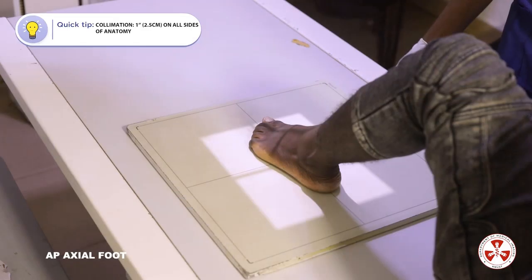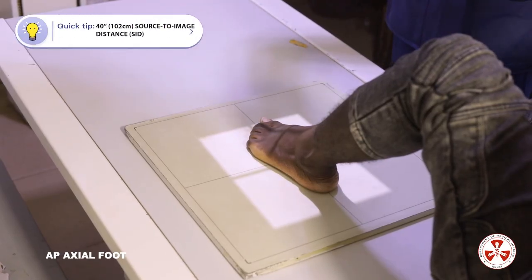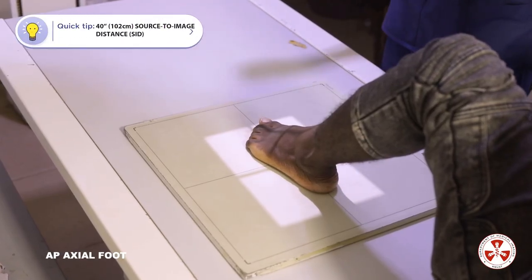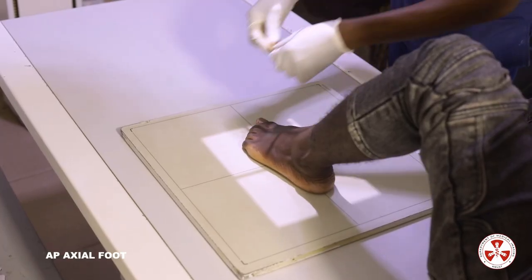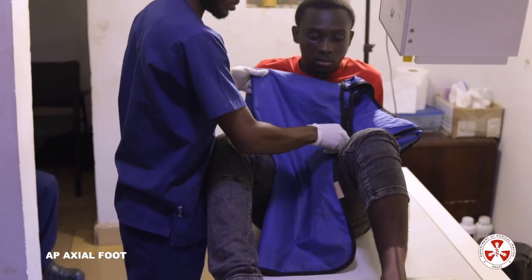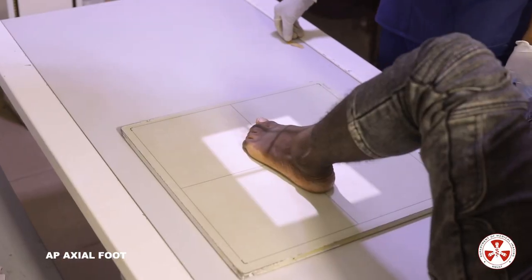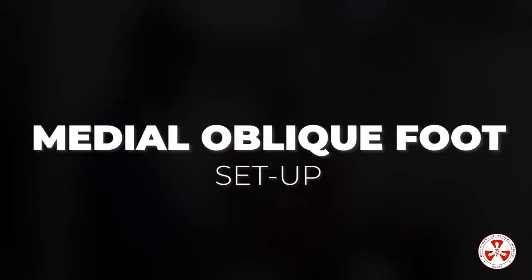Open the collimation an inch on both sides to capture all digits. Place the marker and shield the gonads, then make an exposure. A diagnostic anterior-posterior axial foot radiograph must demonstrate open interphalangeal, MTP, and TMT joint spaces, free of motion and rotation.